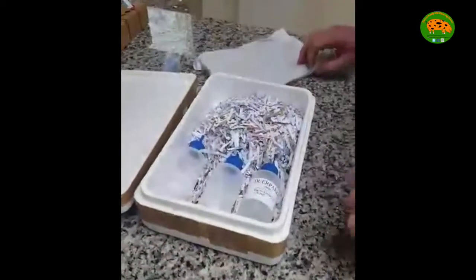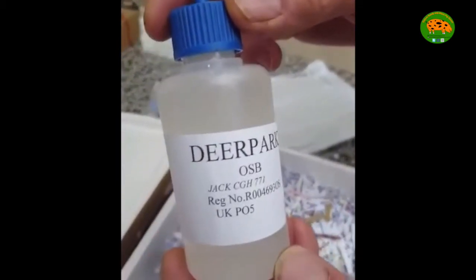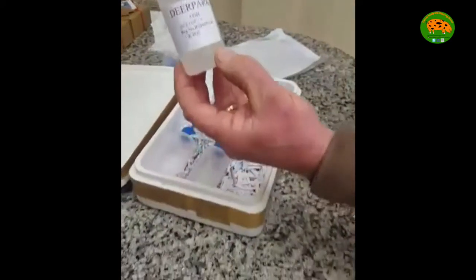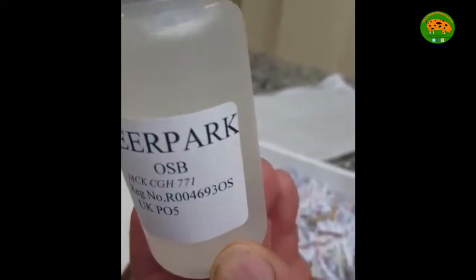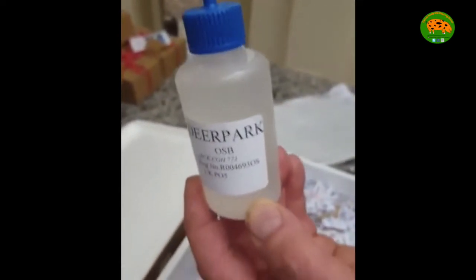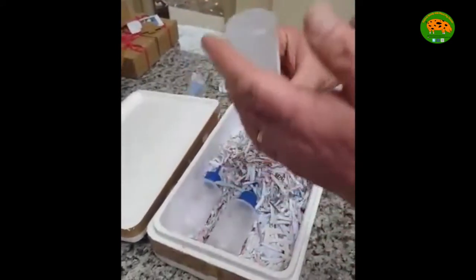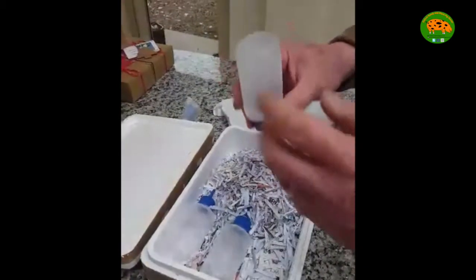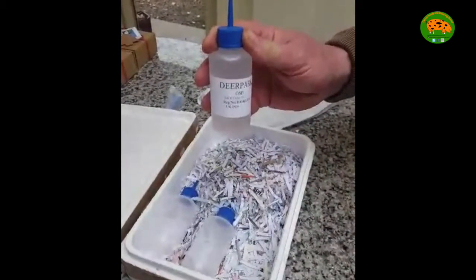So in the box you'll get three bottles of semen. The details of the boar are on there, and you might need to keep these records if you go on to register any of the offspring. The semen itself is suspended in some form of liquid and preservative, so the idea is to keep it warm and you do need to mix it, but don't agitate it too much — it's just a gentle turn every now and then so it slowly mixes in. The semen is supposed to last for up to five days, but we always try and use it as soon as we receive it.